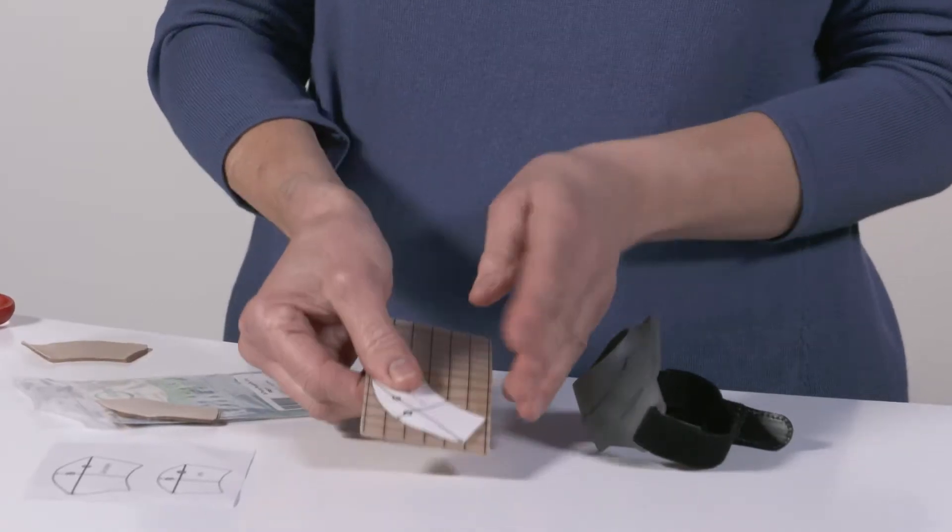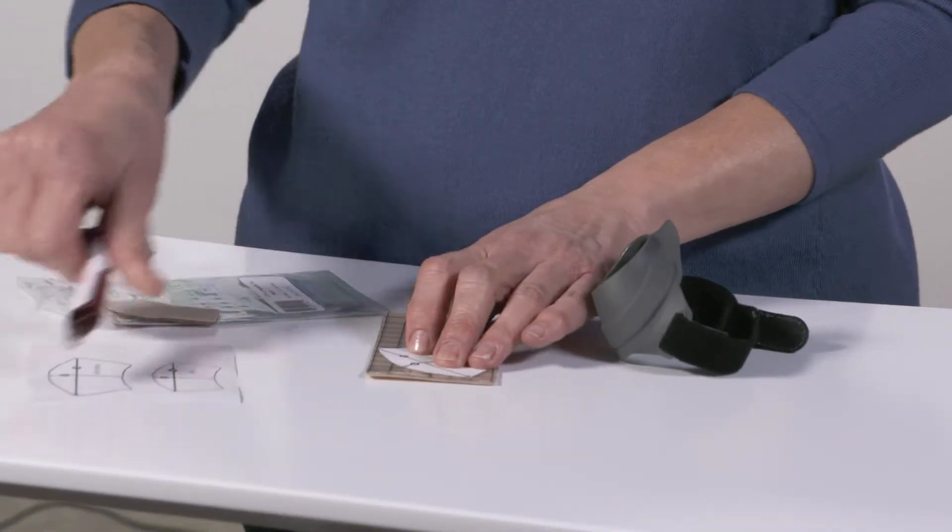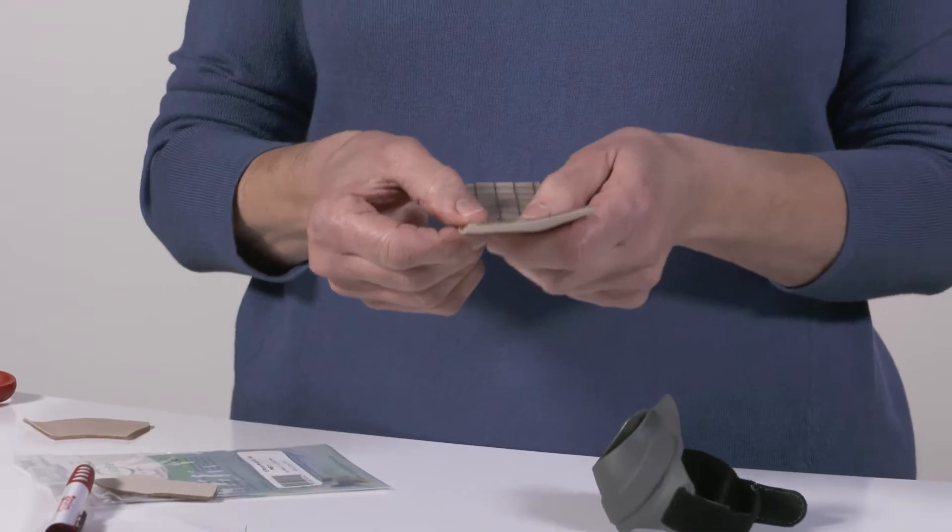Take your pattern, place it on the back of the gel sheeting, and using a pen, trace around the pattern so that you can cut it out of the gel.